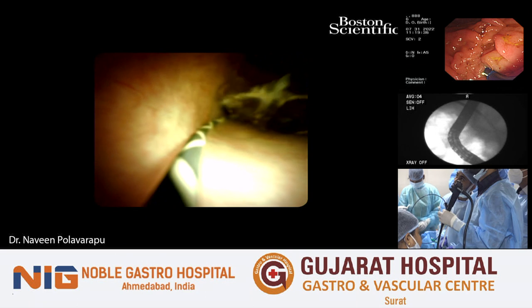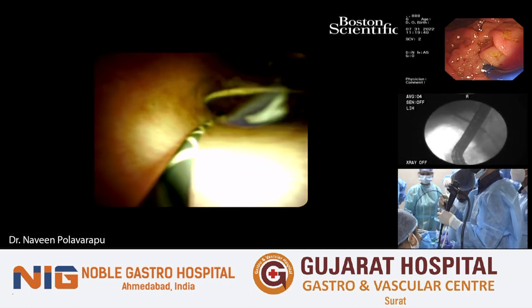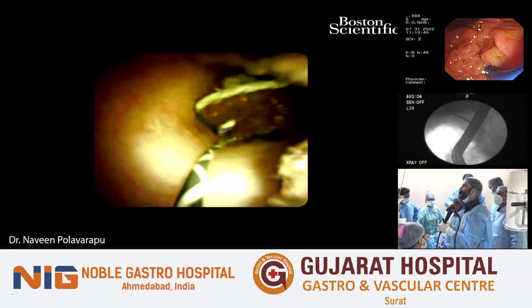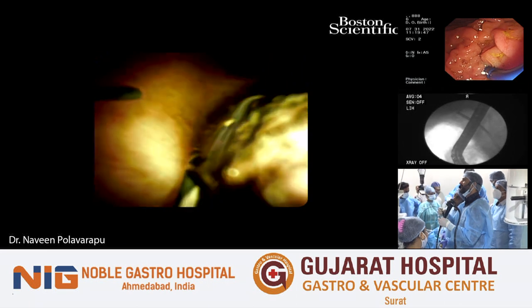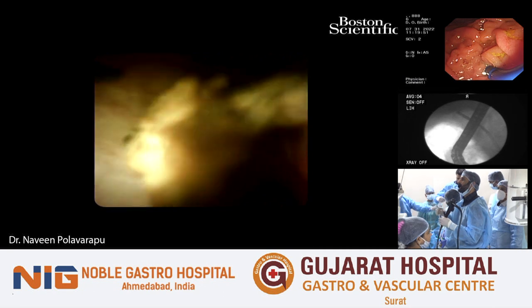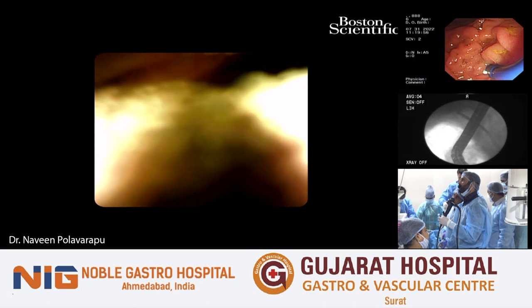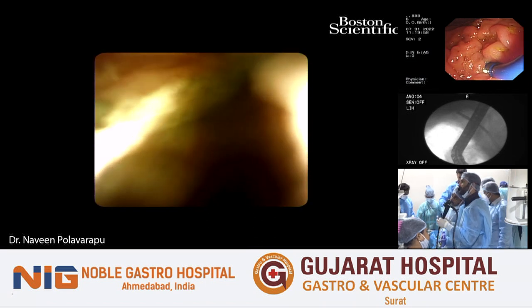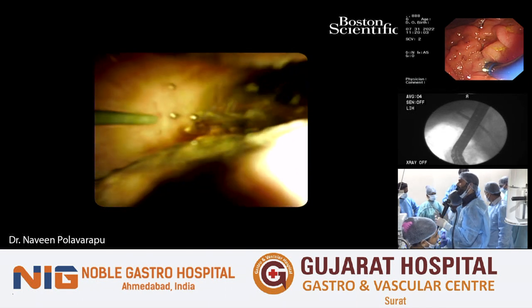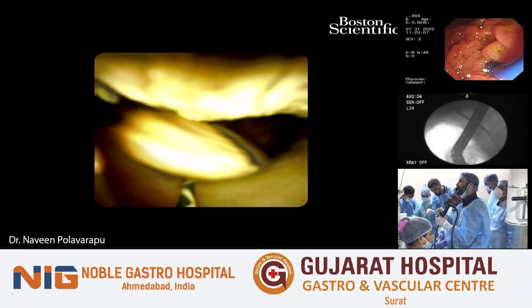What if some bleeding starts at this moment? Do you have any options? Do you have any remedy for stopping the bleeding? Say again, sorry. What if some bleeding starts from the wall of the CBD right now? Most of the times, it's just a small minor trauma that we normally see when there is a bleeding. That is the whole point of using a guide wire, so that you actually negotiate through the guide wire.